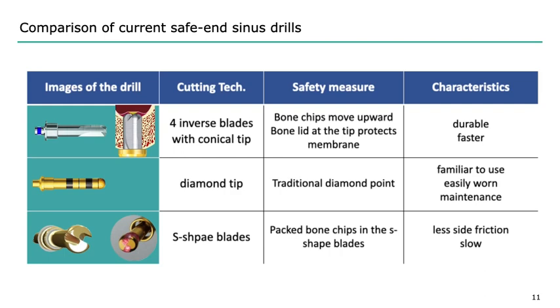The upper third of this drill is a little thicker, so it may generate less side friction during osteotomy because it has a clubbed shape, and this may enable you to feel more tactile sense of the cortical floor when you do osteotomy.